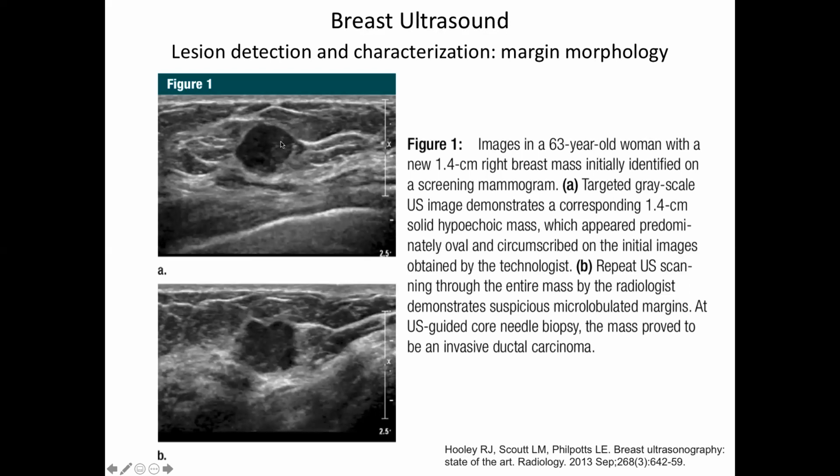So in some respects, it doesn't matter if the modulus means it's stiffer. If it's smooth and there's no features inside it, then you won't get echoes inside it. You'll have an echo off the surface, and then it'll just be a smooth transition until you get to this transition again. So that's why it looks dark.